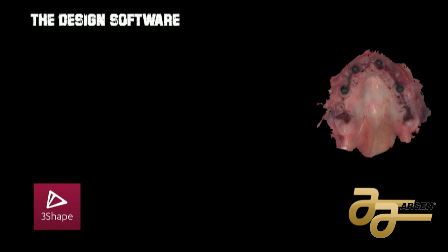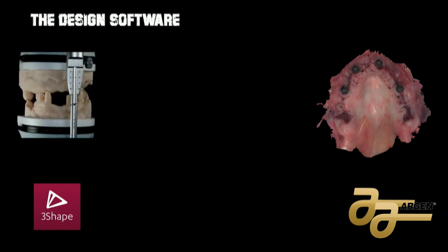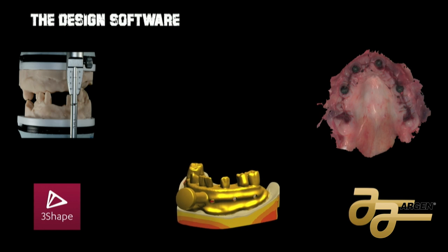The second thing I do is design my models, then print and articulate them. Maybe I am an old technician, but I want to have something physical in my hands, because sometimes on the screen I see things that aren't real. If I have something physical, I can plan the case better. The third thing is a tray for impression. When I do this tray, I put a handle on a denture and use the patient's teeth. When I take the impression in surgery, I take it with this tray and I can preserve the vertical dimension of the patient — very important for the temporary.